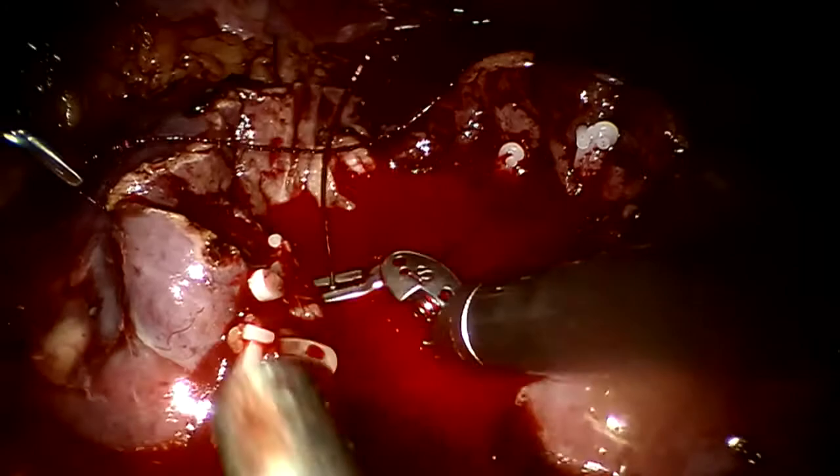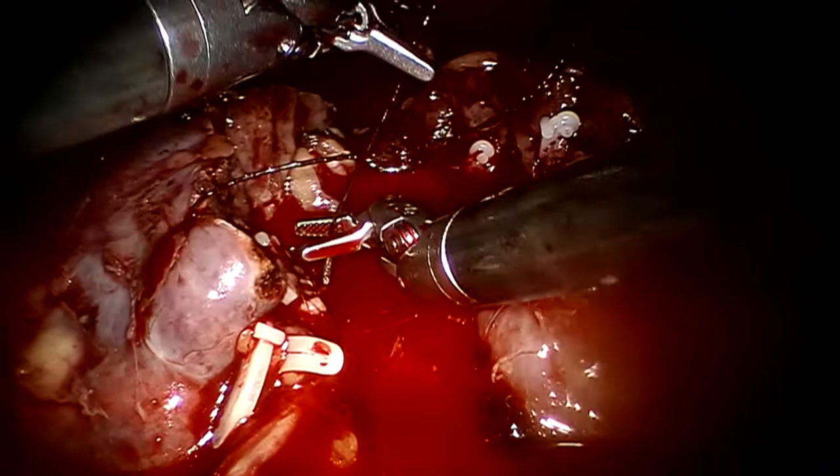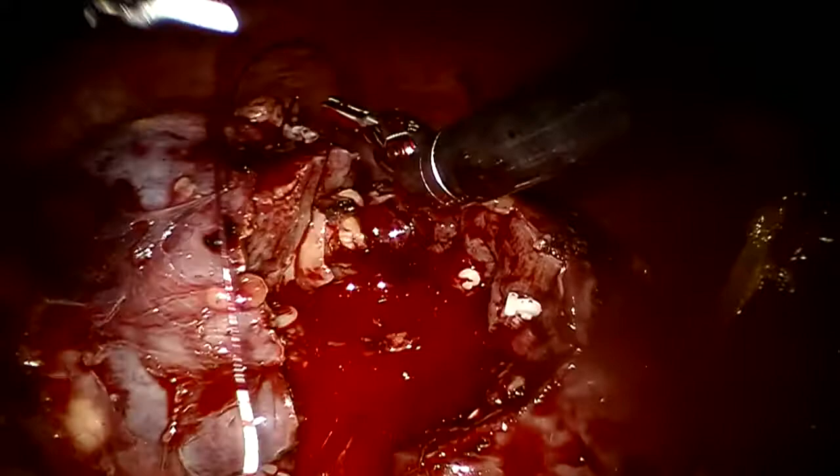So we are going to bolster. We're going to depend on our good friend, the bolster, to come through for us. That's a good one. I am trying at least to be strategic in my stitches. Okay, that's it, no more. I think we got it.